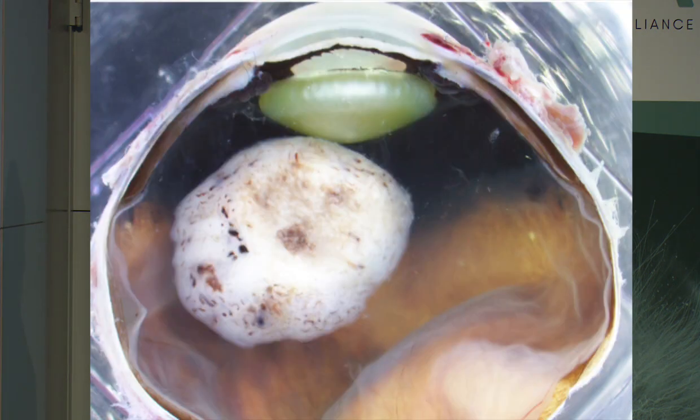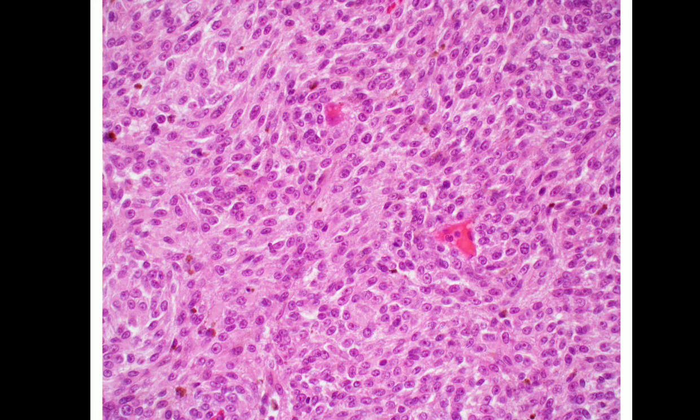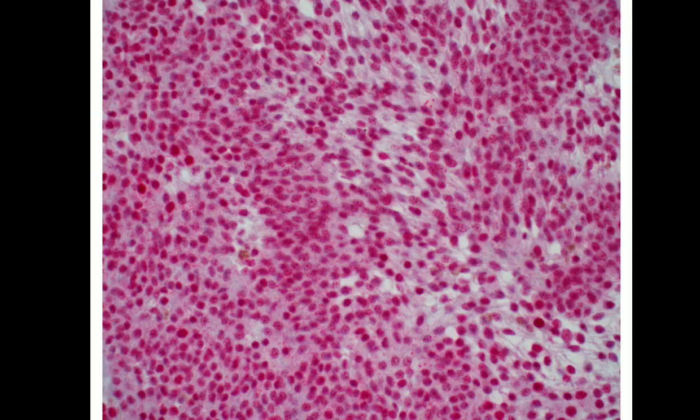I'll just show you another example. Uveal melanomas can be amelanotic. This one's quite white, as you can see, and it happened to be mostly spindle, so that's a lower prognostic histomorphology, and this is what BAP1 looks like in the lower risk group. So you can see really strong nuclear expression of BAP1 in all of the tumour.